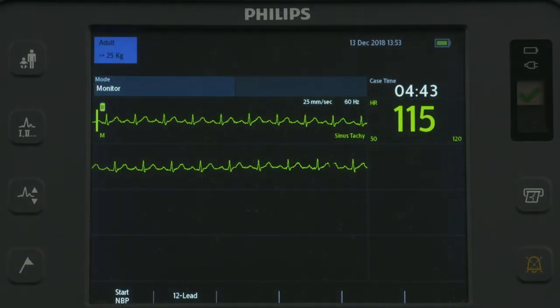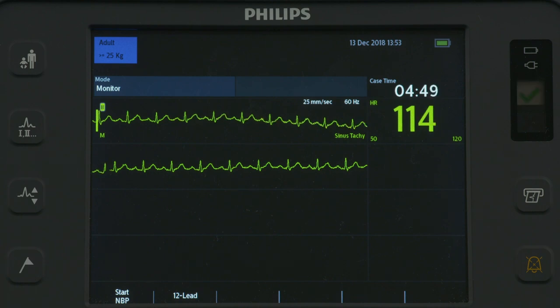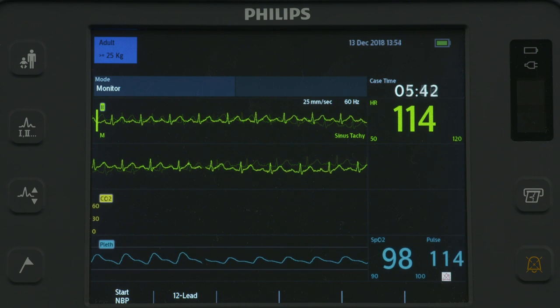In Monitor Mode, you can monitor one ECG waveform acquired through a 3-lead ECG cable set, or up to 4 ECG waveforms through a 5-lead or 10-lead ECG cable set. Optional monitoring of pulse oximetry is also available.